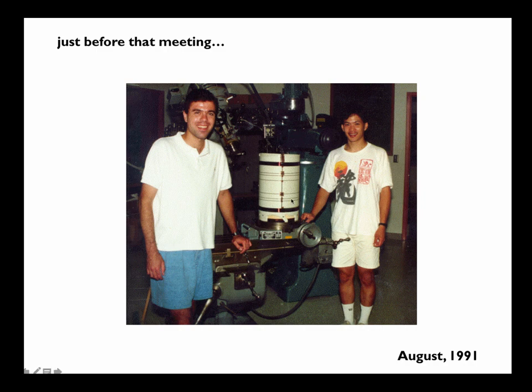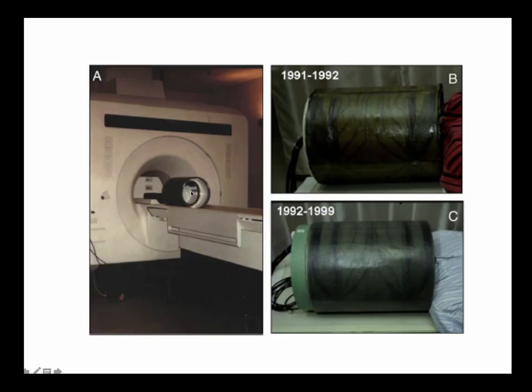We were pursuing it for a different purpose at first. Eric wanted to do perfusion imaging in the brain. He needed echoplanar imaging. But we were ready to hit the ground running once ISMRM happened, to do functional MRI on our scanner. And this is how the gradient coil looks. It was just simply placed on the scanner table, which was potentially kind of dangerous, but back then we didn't have any IRB or any sort of safety committee or anything like that. So we were working at like 2 in the morning, and I was the guinea pig for a lot of the experiments. This is me in various versions of our scanner.